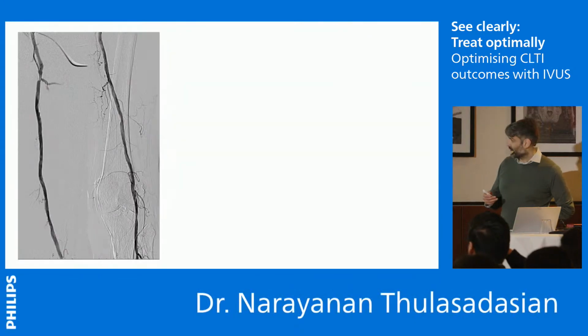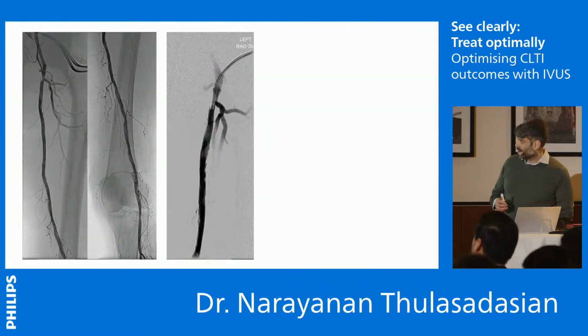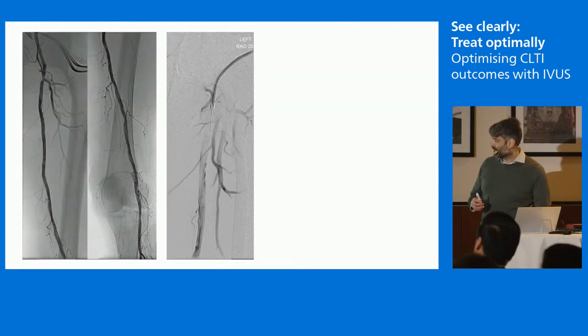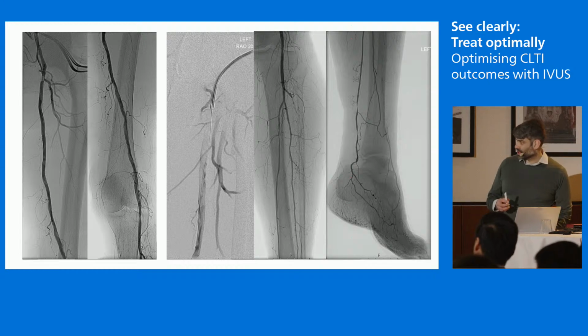And this is the angiographic result. You can see good flow there. Checking just at the top, coming out of that common femoral patch to make sure there's no stenosis there, and you can see the runoff has been preserved.